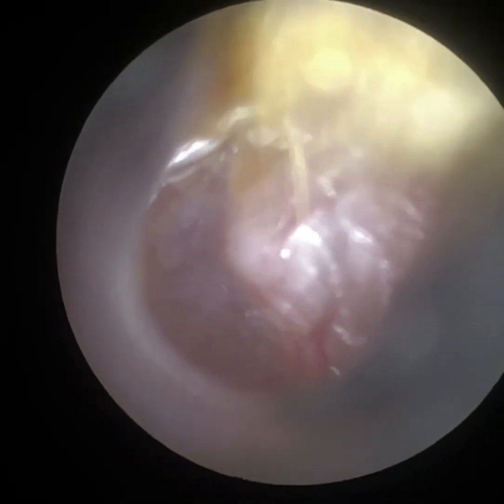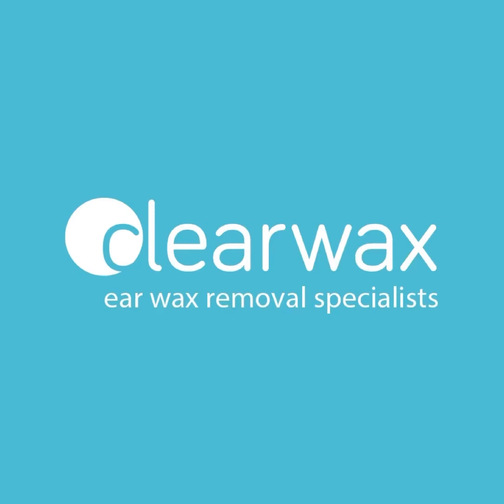The eardrum is still a bit dull. You can see there's the handle of the malleus — it's slightly inflamed. I hope you enjoyed that video. Again, if you are interested in the Waxscope, please do email info@clearwax.co.uk. Thank you. Bye.